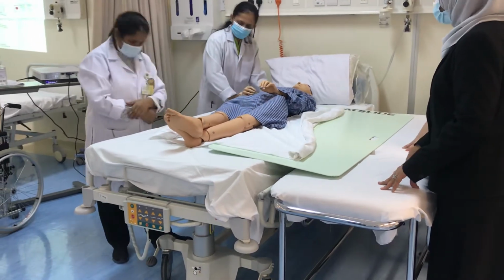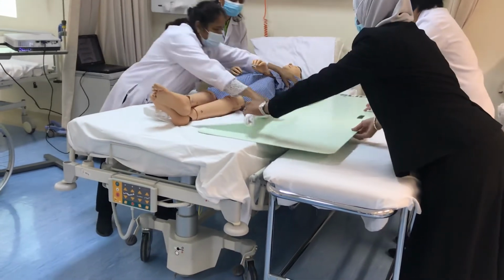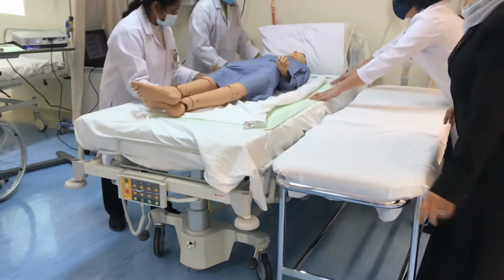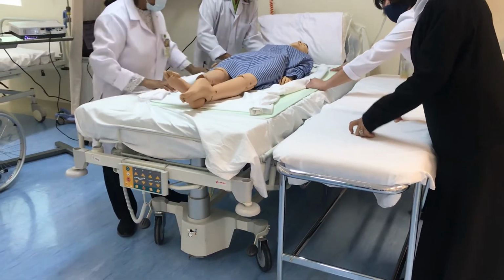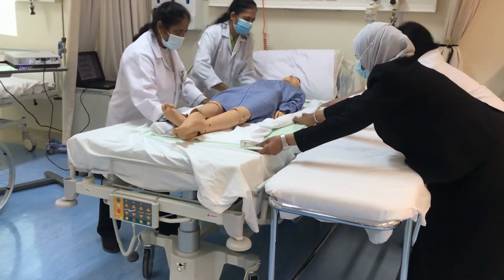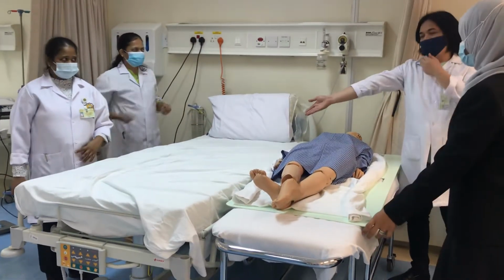The head is supposed to be like this. You just put this one under first so that we will fully see. Okay. Like this. Okay, you just need to pull this one. Oh, it's better. 1, 2, 3. See? Easy. The same process when you transfer the patient to that side.